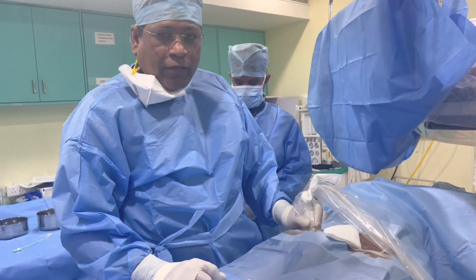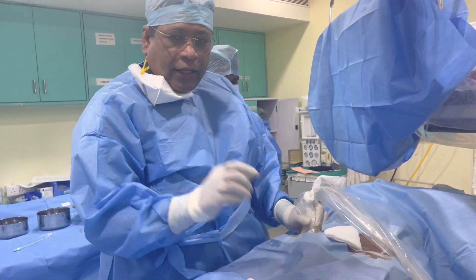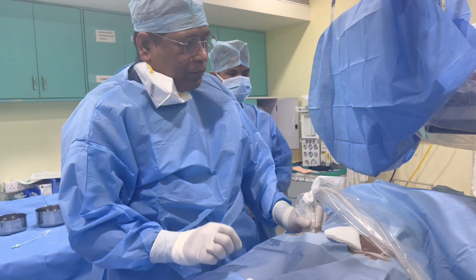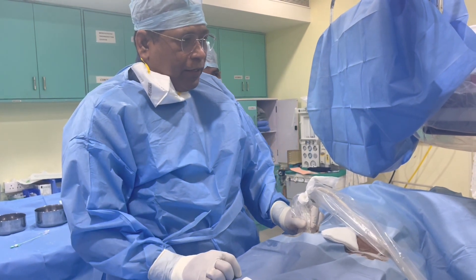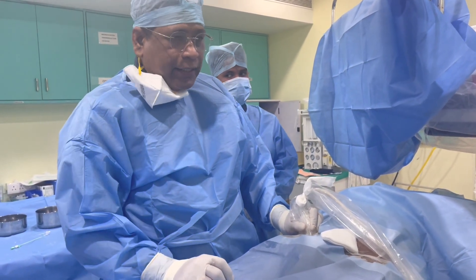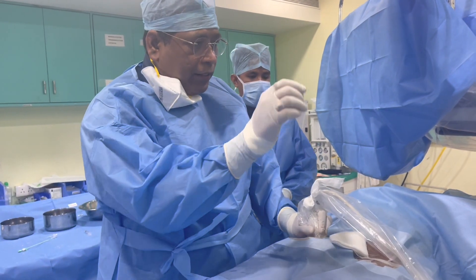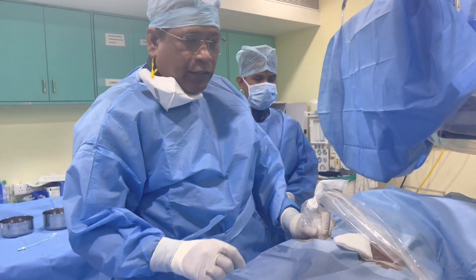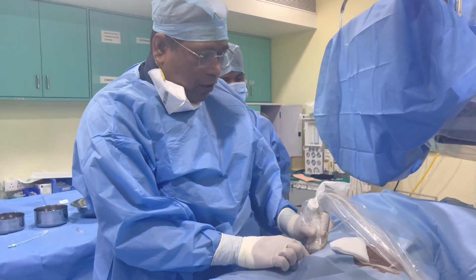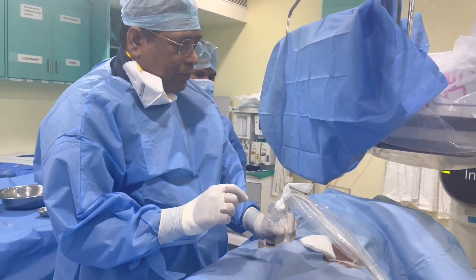I am Dr. Dilip Kumar, Director of Catholic Medica. Femoral puncture is very important and we have to do a lot of structural interventions, and access is very very important. The right place needs to be chosen. I will show you how to do image guided puncture.